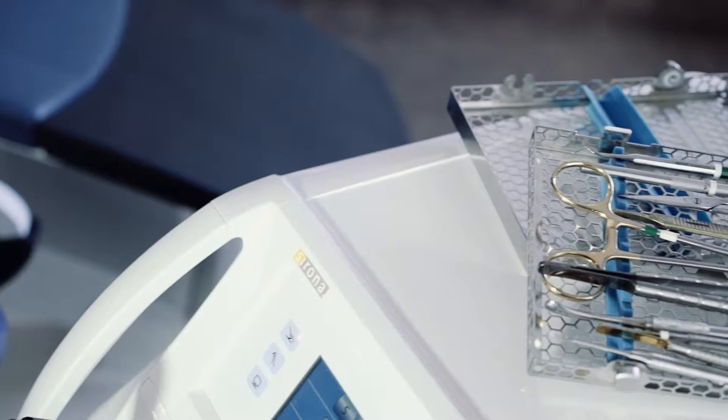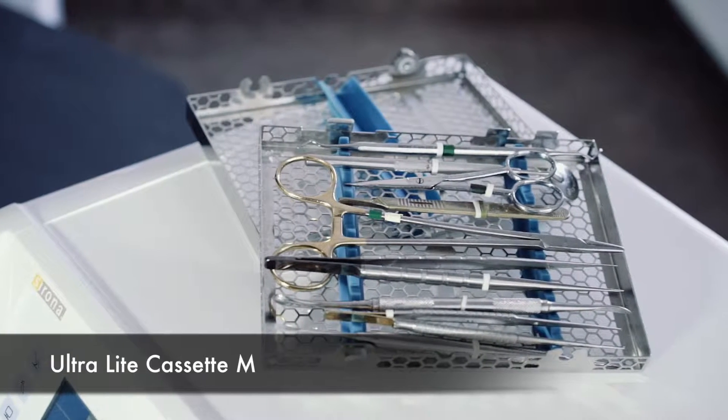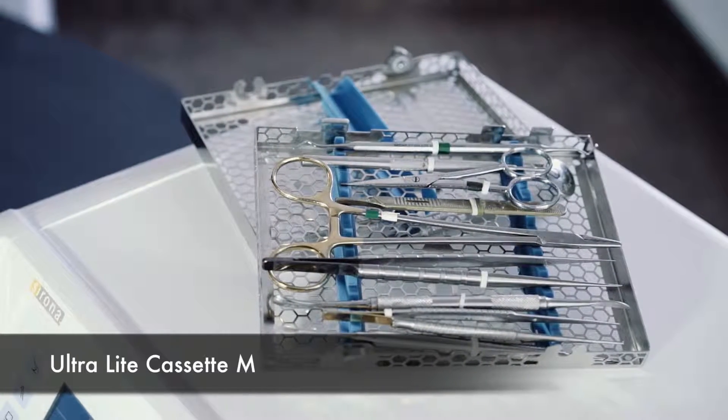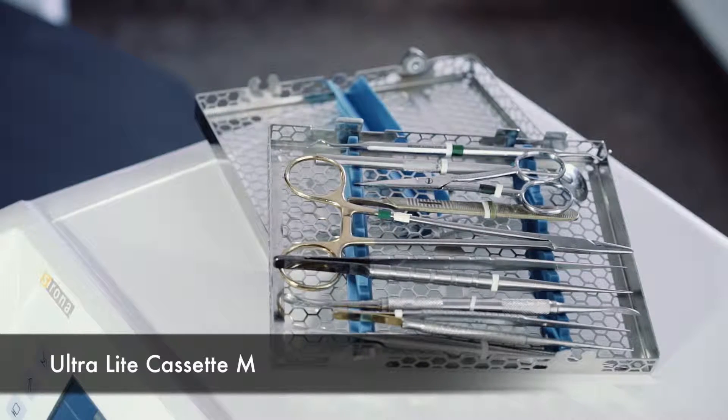Next up, we have our ultralight medium cassette. It's obviously a slightly bigger sterilization cassette than the previous one. Dr. Nick, could you tell us what procedure you use this for and how it works for you?